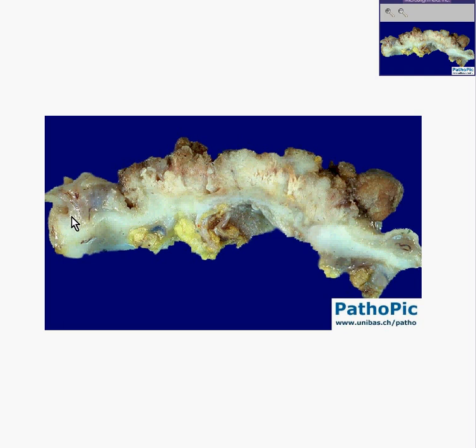I think when you get back out here again, you can see more of a uniformity of the wall. It looks like this may be submucosa. This may be a thin rim of uniform mucosa again. So my guess would be that I'm going to exactly delineate the limits of the tumor right now.